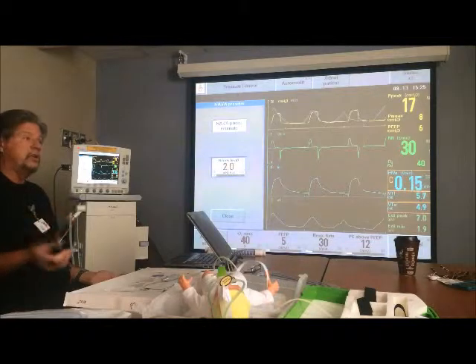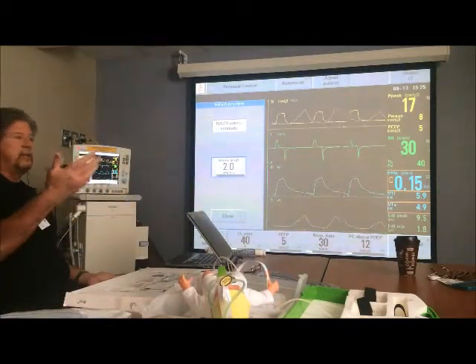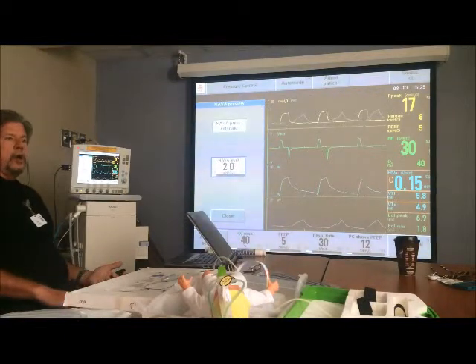The same idea, it's not hard, but translate it to just plain pressure support, and think about what the brain would do if your baby was happy, but you came along and turned the pressure support up to double what it was. What would his brain, whoa, what's up? He would lower his effort down, because he wouldn't want all that support.